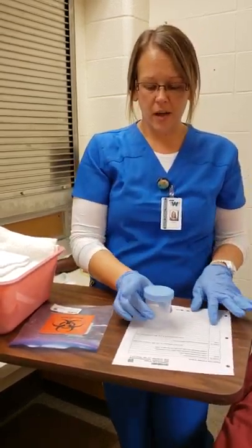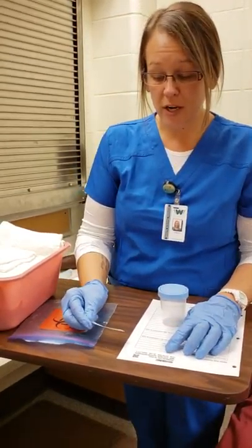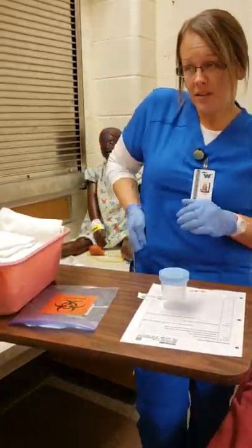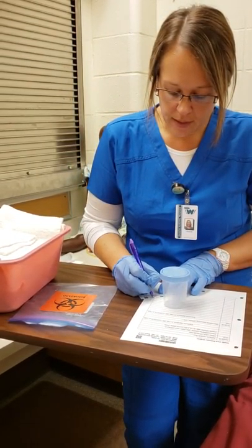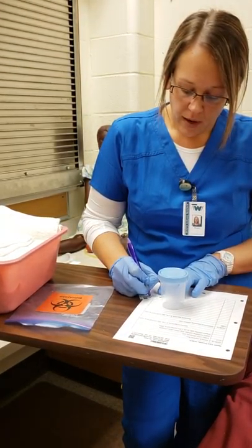In a perfect world, our patient would start the urine stream, then stop, place the cup to catch a midstream sample, stop the flow again, pull the cup out, and continue to urinate. She would then cover the cap and bring it out to me. At that point I would grab my gloves. I have the urine cup with a label — for my order I'm double-checking: Shirley Cole, 54-year-old female, date of birth 5-14-1964.